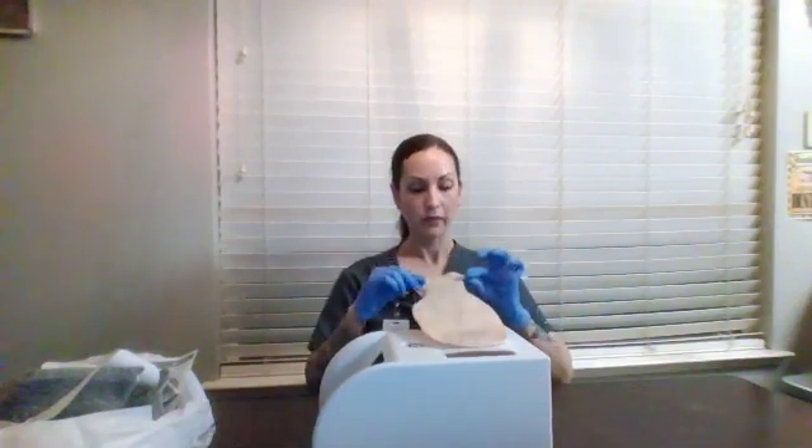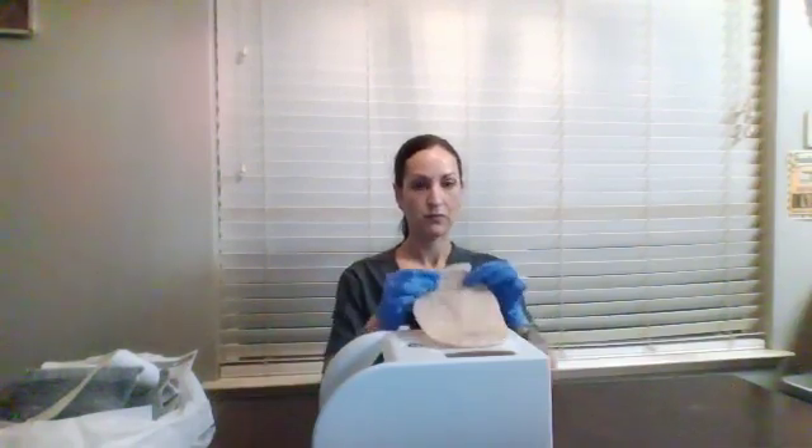Then we're going to take our new colostomy bag and apply it — listen for the click. At the bottom of the bag there is a ring. Now we're going to have the patient place their hands over the stoma to warm it up to body temperature.